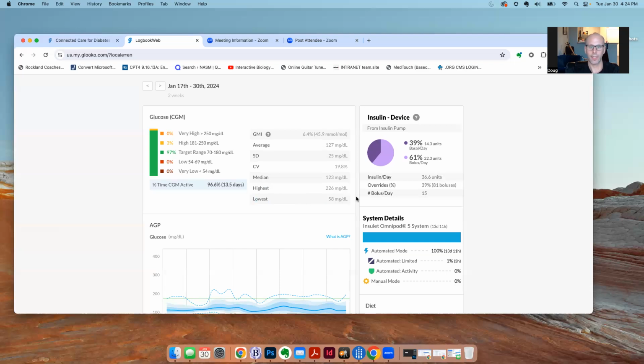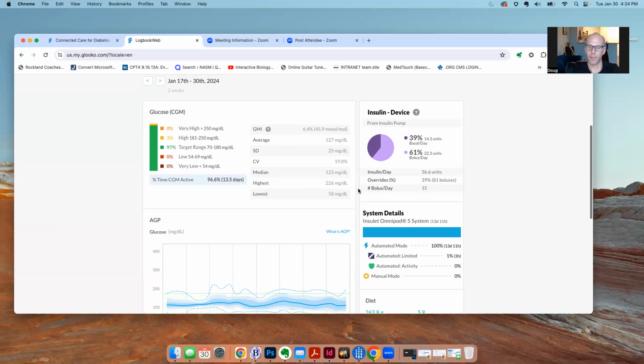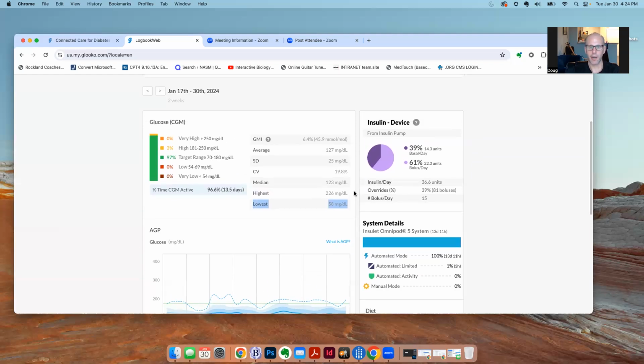And so again, this works for me just because I kind of like to have the automated mode giving me a little bit of insulin, even if I'm exercising, just because I don't want to actually be in this 220 to 230 range. I feel like I just don't feel as great there. So I'm okay with it correcting. But if anybody was struggling with a ton of lows after the workout and they were leaving their Omnipod in automated mode while they were exercising, I would encourage you to maybe then try exercise mode or activity mode, because then it's not going to at least correct.